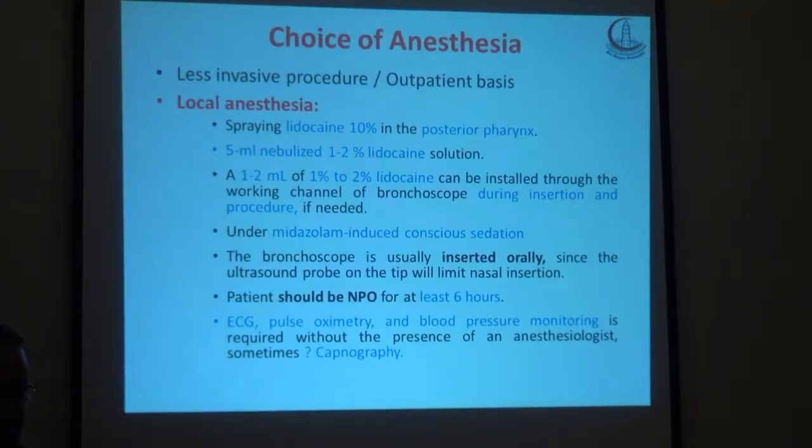في بعض الناس الليفر، طبعا عندنا ليفر ديزيز كتير في مصر، فممكن يحصل توكسيستي بالميدازولام، فالفلومازينيل اللي هو الانتي دوت بتاع الميدازولام يفضل يكون موجود عندنا. طبعا هو فيري اكسبنسيف لكن بتلاقيه في وحدات الجي آي تي اللي عندك في المستشفى، لأنهم بيعملوا مناظير للعيانين اللي عندهم هيباتيك سيل فيلير، فبيبقى موجود، فيبقى عندنا الفلومازينيل. المنظار طبعا لازم يخش أورالي لأن السايز بتاعه ضعف، يعني 1.5 المنظار العادي. طبعا العيان بيبقى فاستنج قبلها 6 أورز.